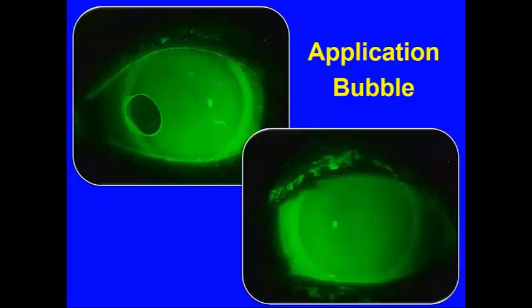Now, for all of you who have applied a scleral lens, you know by now the number 1 complication is a simple air bubble underneath the lens. This happens when the lids are inadvertently touched or the patient should move their eye during the application process. It's important to remember that there is no way to expel these bubbles. The lens just simply needs to be removed, fresh solution applied to the back of the lens, and then the lens reapplied to the eye.